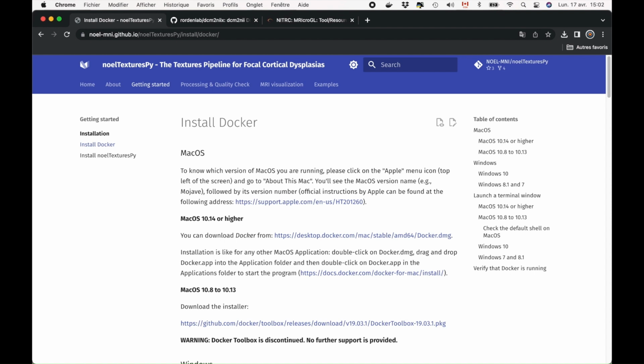You will also need an MRI visualization software. We recommend installing the MINC Toolkit, available on macOS and Linux operating systems, which includes the visualization software Register. Alternatively, you can use the visualization software ITK-Snap, available on all platforms. Further details are given later in the video.